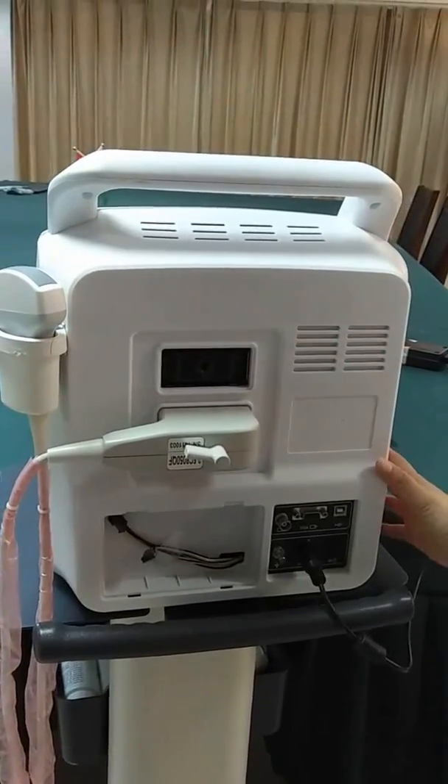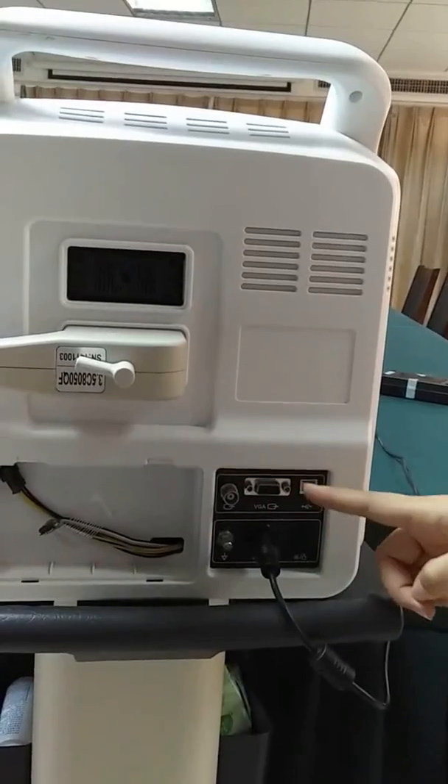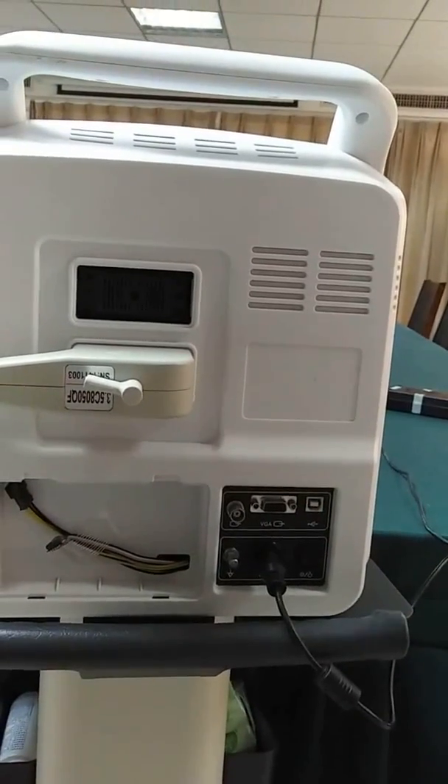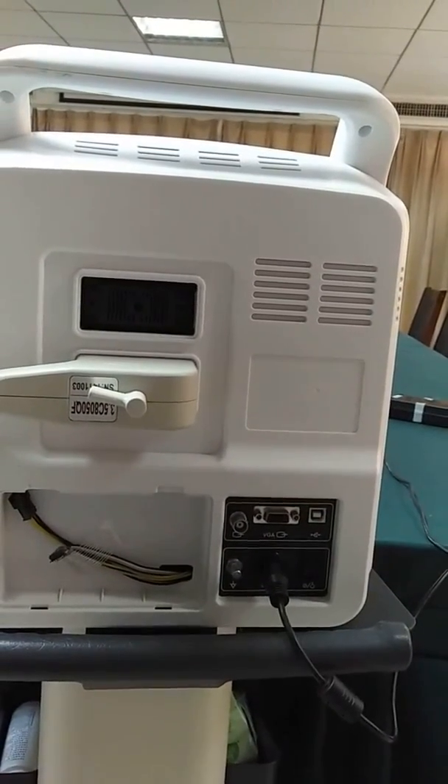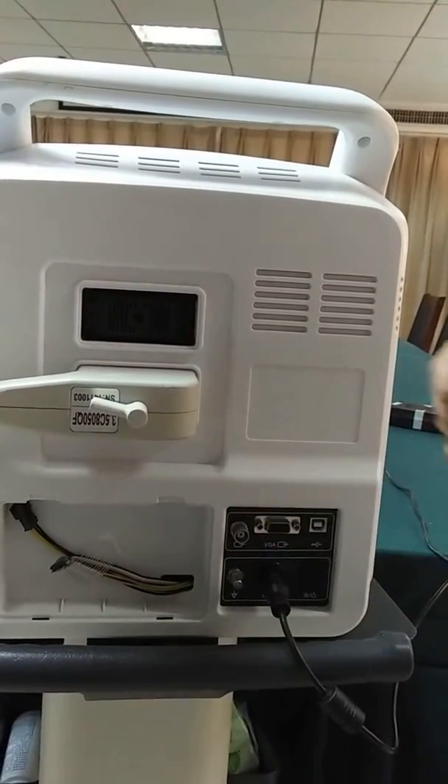This area is above the ports. You can see video ports here and VGA ports here. You can connect a video printer to this machine through this port.